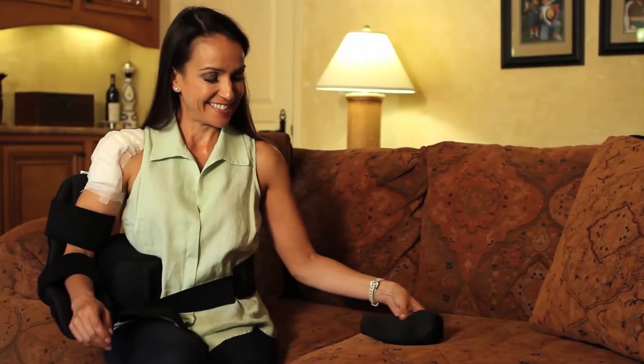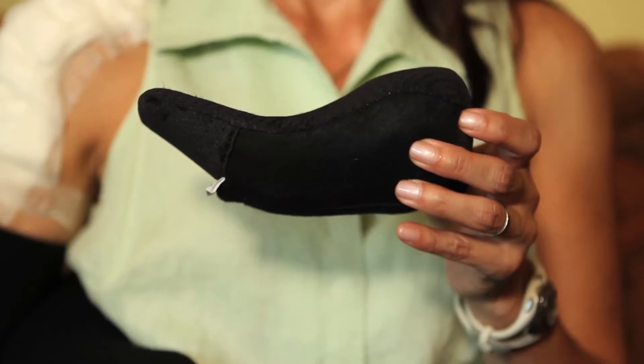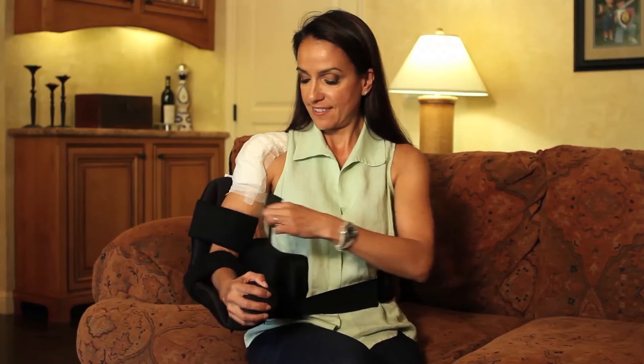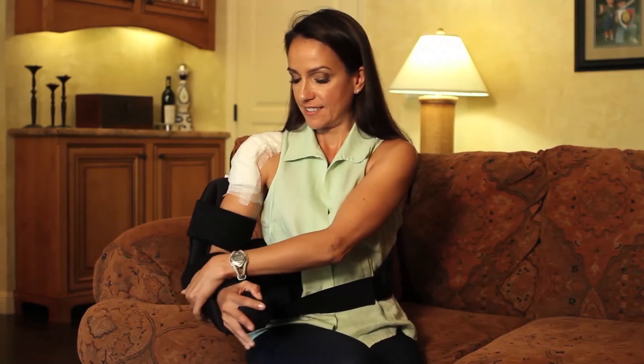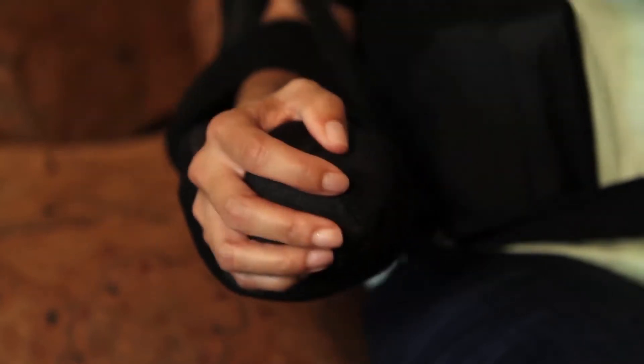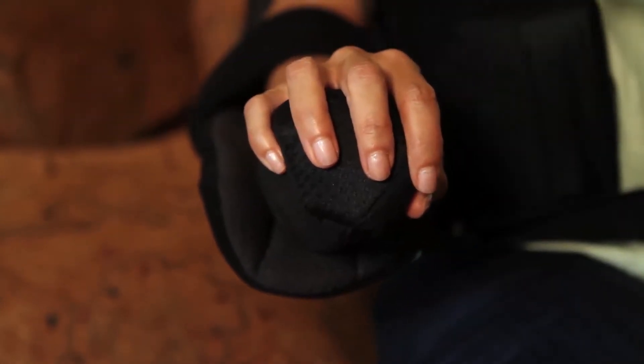The wrist bolster can be used to provide additional support for the hand and wrist. It is placed into the cradle alongside the hand and the wrist strap closed over it. Alternatively, it may be placed directly under the wrist if more support for the hand is needed, again secured by the wrist strap.